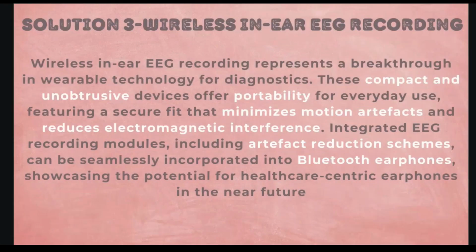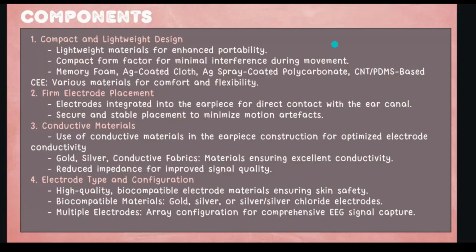Last but not least, solution 3 is a wireless in-ear EEG recording. These compact devices provide portability for everyday use and ensure a secure fit, minimizing motion artifacts and electromagnetic interference. Compact and lightweight design: lightweight materials are used such as memory foam and silver-coated cloth for enhanced portability.